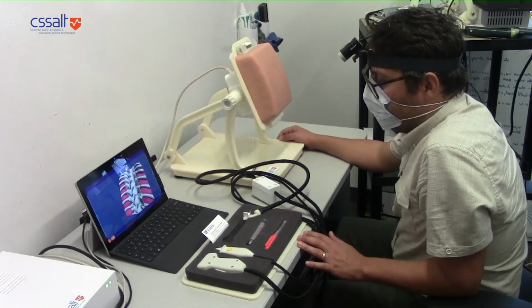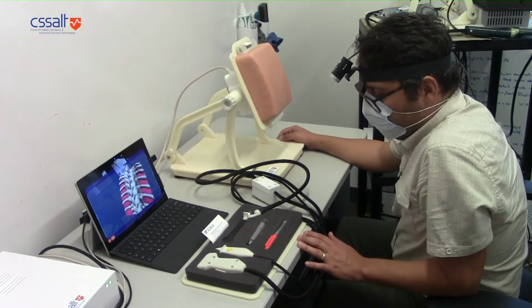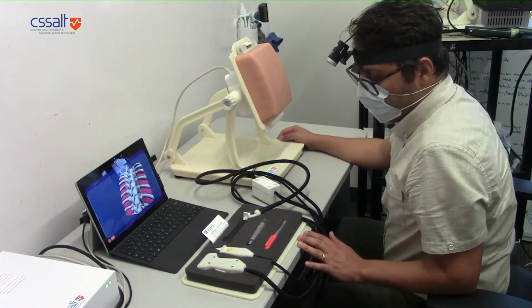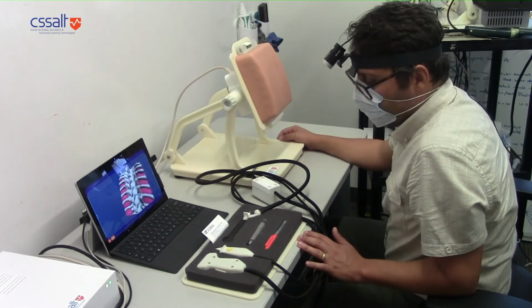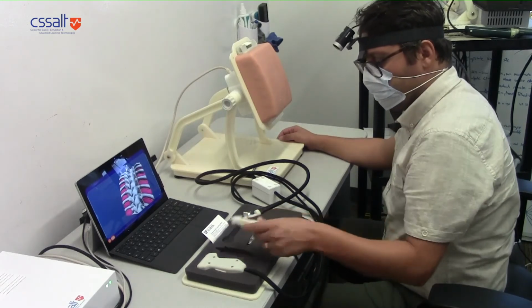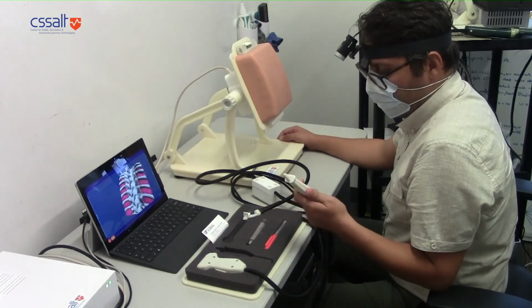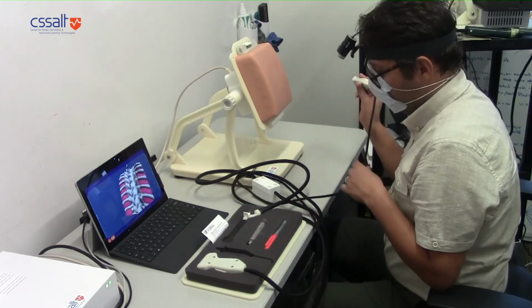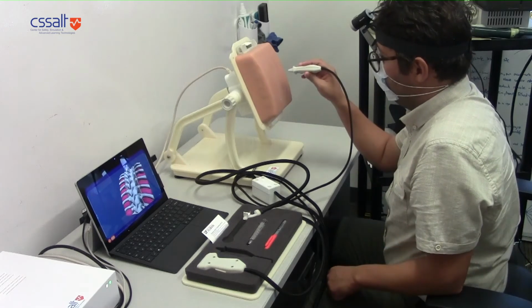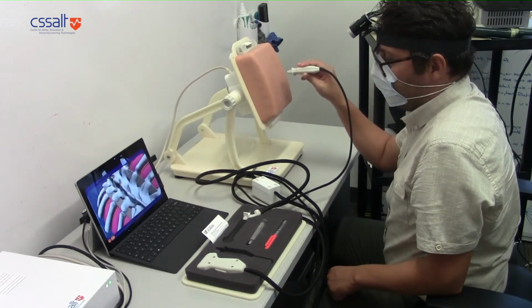I would like you to look at your tool tray, and you can see the ultrasound probe on the left. And right next to the ultrasound probe is the smaller probe. If you could pick that up, that's a camera controller. Point that at the anatomical block and press the button, and you'll see the anatomy from the perspective of the probe.